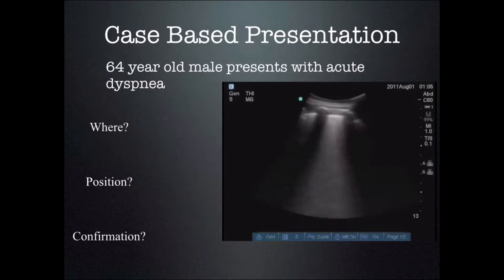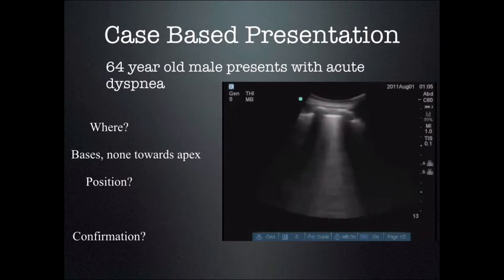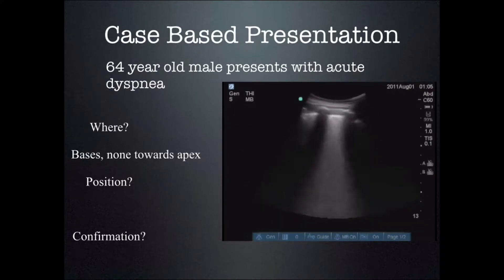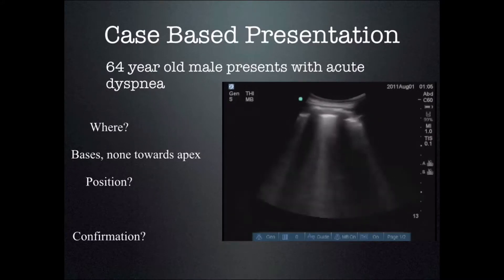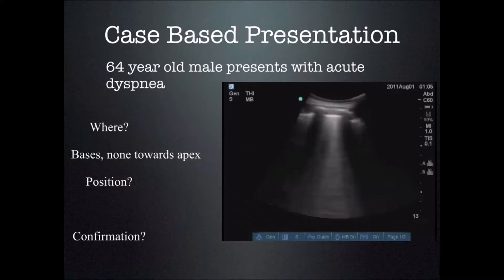The probe is at the base and you find lots of lung rockets on both sides, and as you move up the back the lung rockets become less and less numerous. Near the base we see so many lung rockets in each intercostal space we can't even count them. As we move up it becomes three, then two, then one, then none towards the apex. That means there is more fluid towards the base, because the number of lung rockets is proportional to the amount of fluid in the interstitial septa or alveoli.